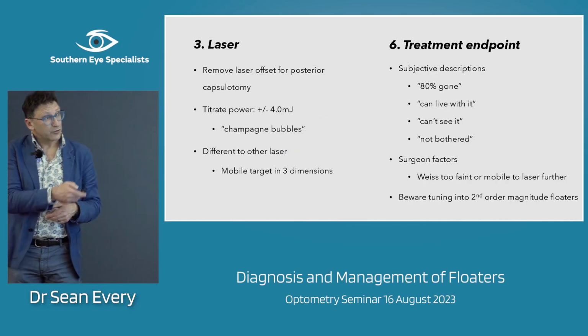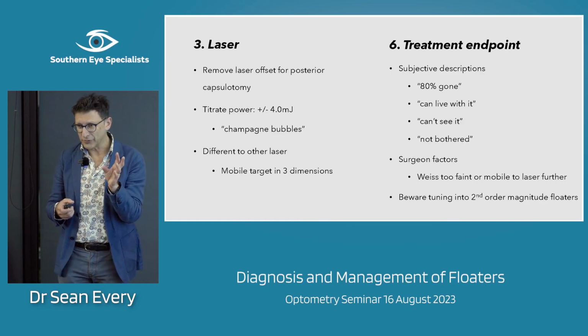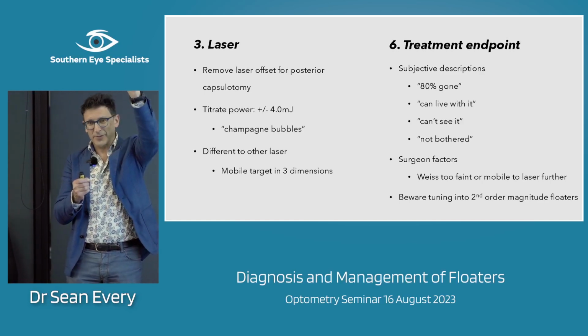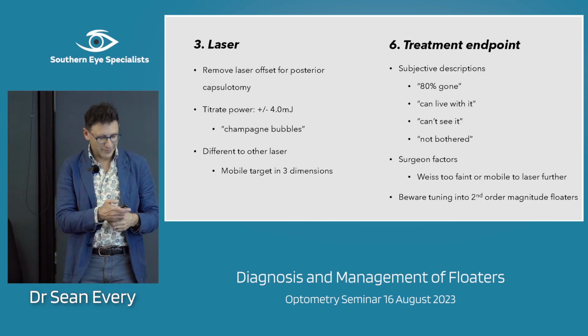So, we talked about the laser. The end point is that you see something like champagne bubbles. You're vaporizing these little bubbles, and the patient sees them, the retina inverts everything, so they see them dropping down to the floor.